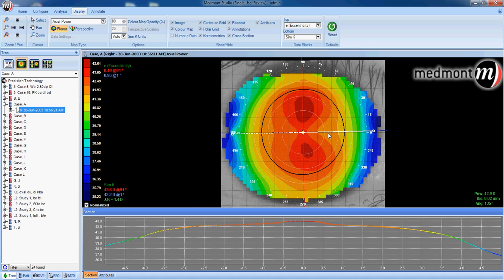This would be a with-the-rule corneal astigmatism. We can also interpret from the axial map that this is an apical astigmatism. The figure-eight or bow-tie shaped astigmatism is very much central or centralized within the pupil.